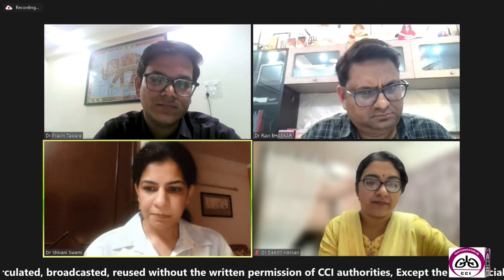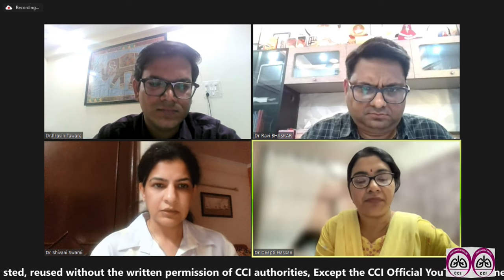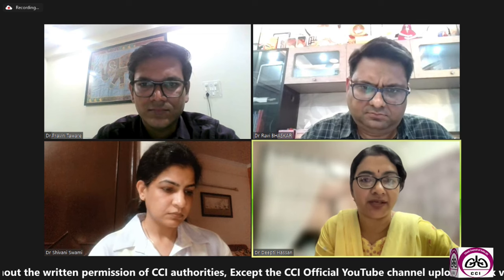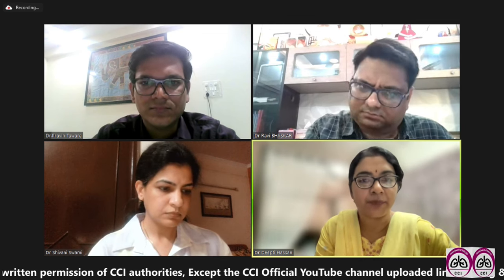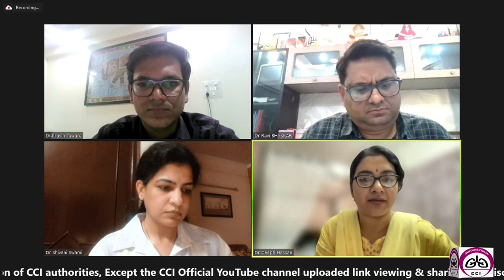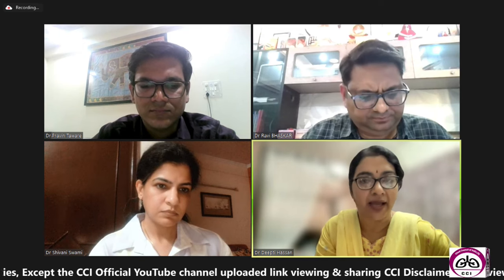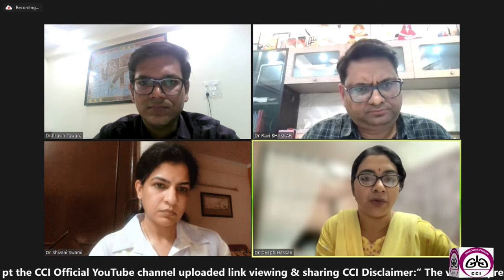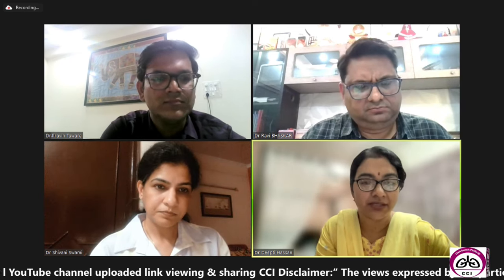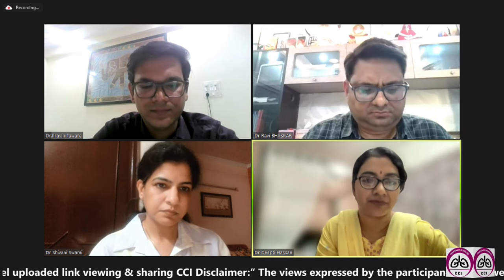Dr. Deepti. So this was already mentioned in the talk, ma'am. The lung deposition was seen with a breath actuated inhaler. It was almost 20% more than the other inhalers. But apart from that, if we see a good technique, an MDI with a spacer will also be equally as good as a breath actuated inhaler. But when you compare just the devices, it is the breath actuated inhaler which gives the best deposition.